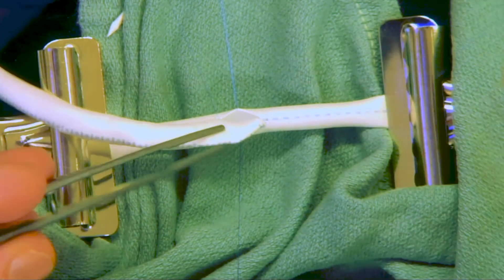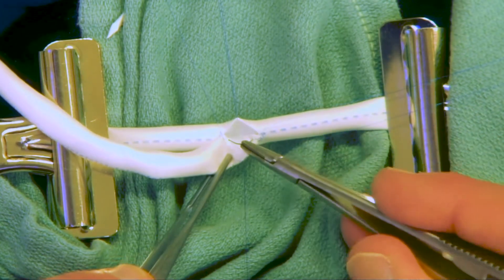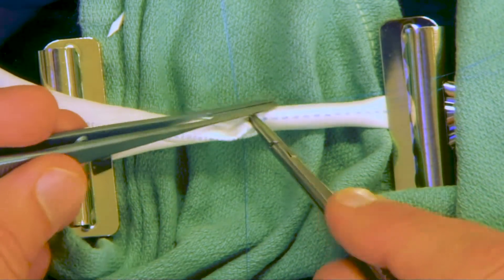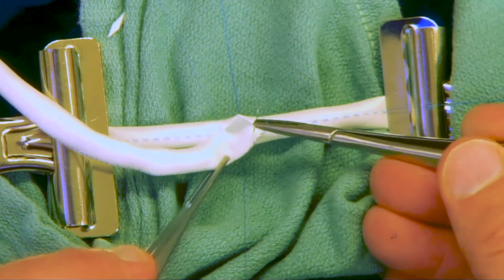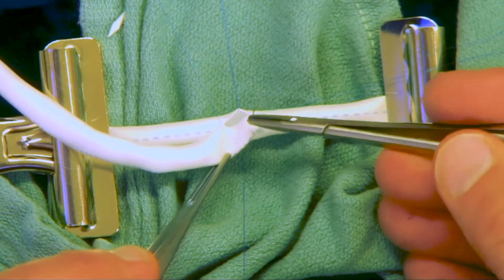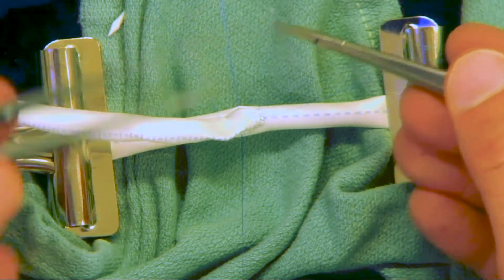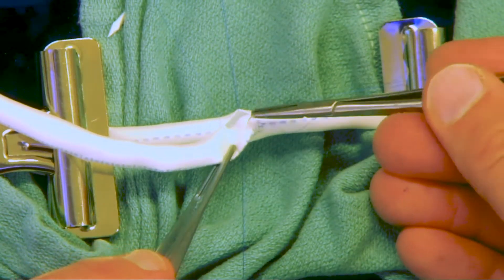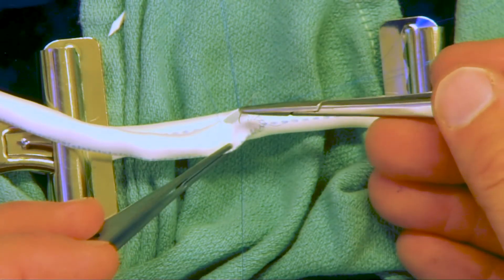In fact, if you'll just distract the two vessels apart, you can many times get the suture to go where you want using the sharpness of the needle to penetrate through. Focus on keeping the action of the anastomosis right there in the field so that you're avoiding wasted motions. Loading the needle elsewhere and having lots of extra maneuvers is simply not good efficiency of motion and time, and will make the anastomosis go much slower.